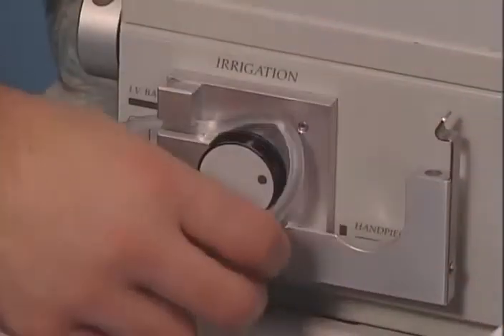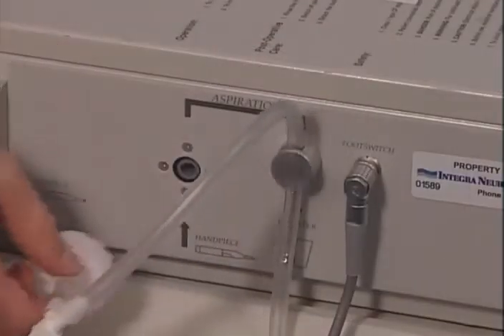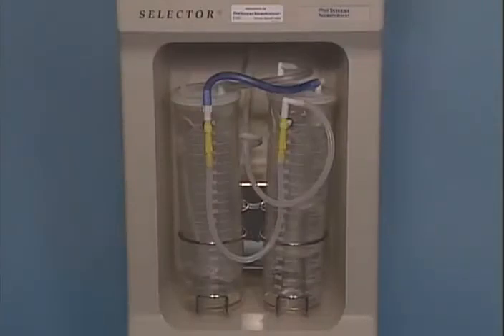Remove the irrigation tubing from the pump and the pinch valve, and remove the aspiration filter from the console. Remove the liners from the suction canister and discard the tubing set, suction liners, and IV bag according to procedures for disposal of contaminated waste.